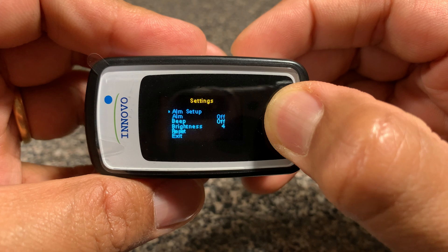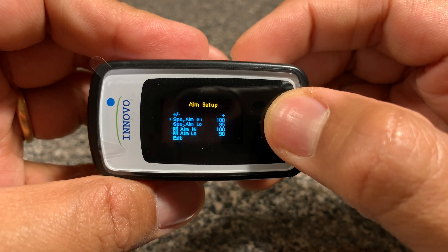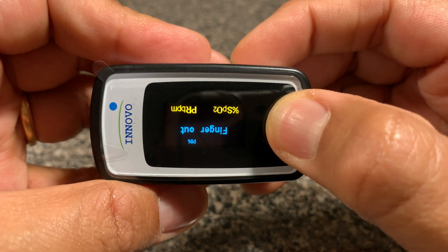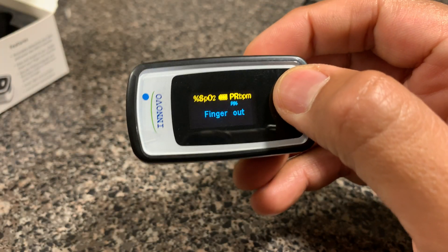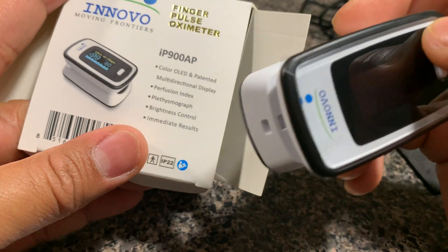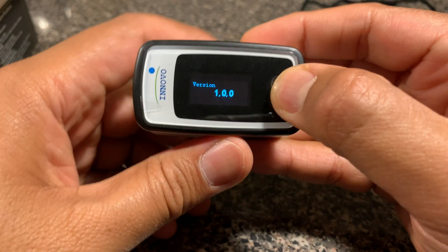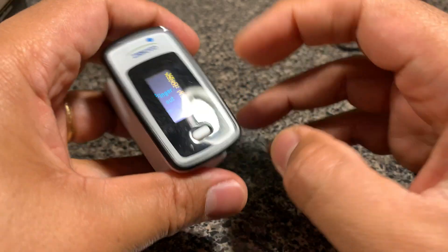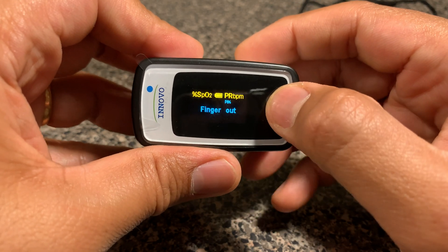I want to show you the alarm setup functionality. If you press for about two seconds, it goes to the next mode where you can set the SpO2 high and low thresholds at which you want the alarm to go off — by default it's set at 95, which is considered normal. This is also a good opportunity to show that you can change the display orientation, which is what the packaging calls the 'patented multi-directional display.' You can use either your left or right hand, so you might want to flip the display orientation to read it comfortably.